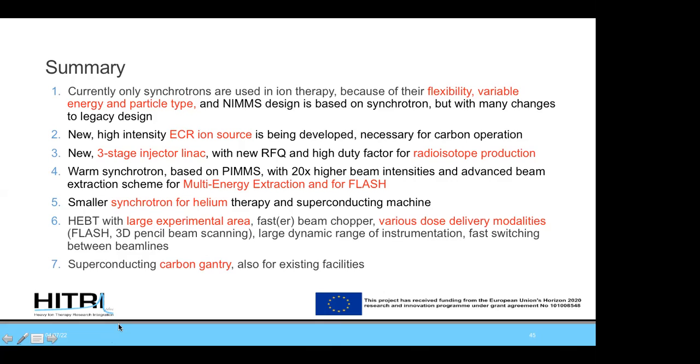Okay, so currently, heavier ions are interesting for research purposes, especially radiobiology, and also for space radiation. So different kinds of research in radiobiology. But then about fragmentation, which is already present for carbon ions, there are actually some studies, again the Japanese are pioneers on that, but also at GSI and HIT they go in this direction.